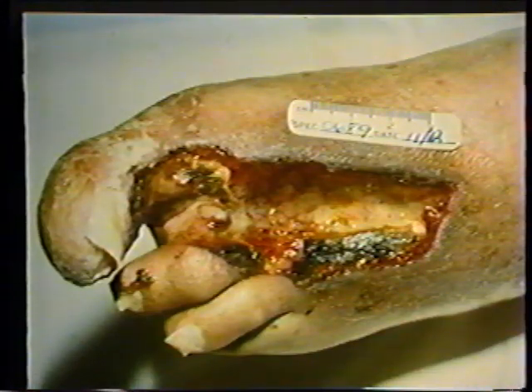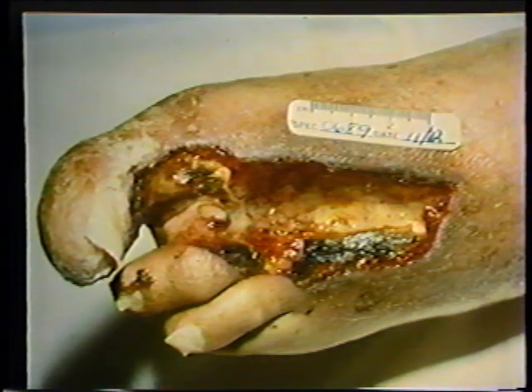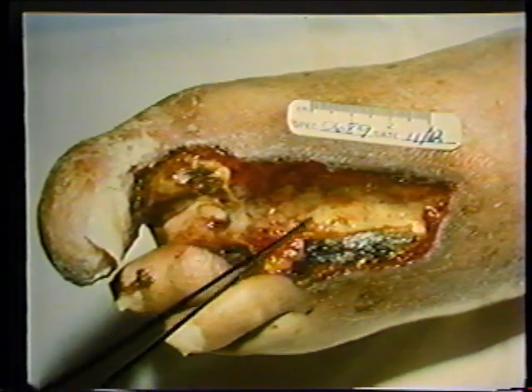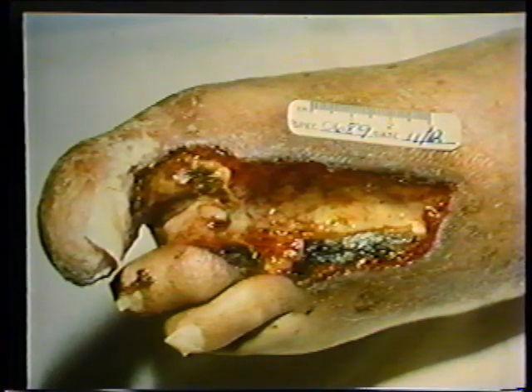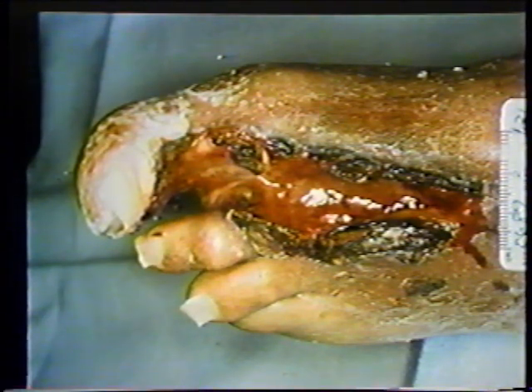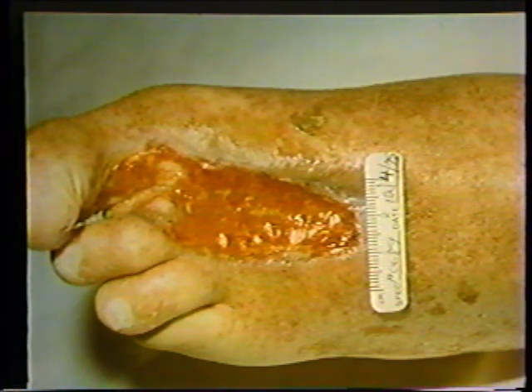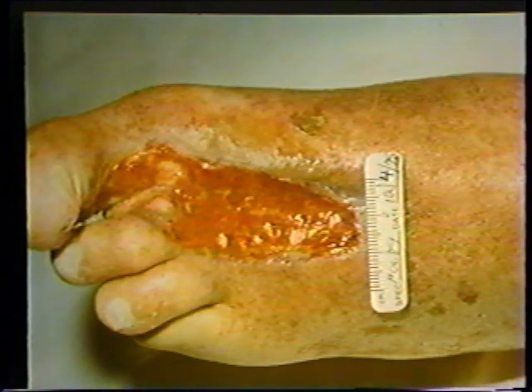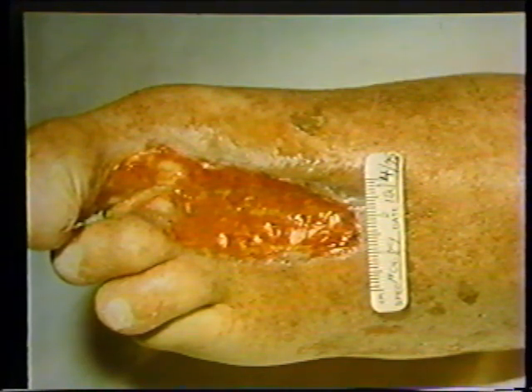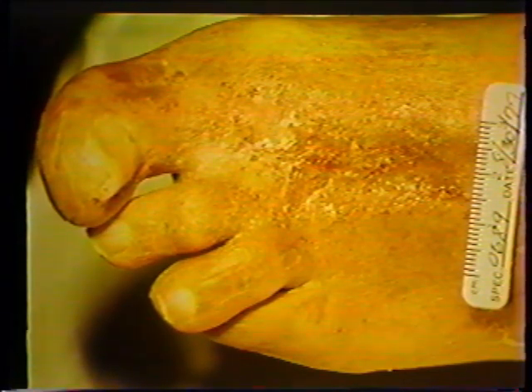Here's an example: a patient with severe arthritis with accompanying vasculitis. The surgeon was about to remove one more ray — he felt it was impossible to close the wound. Note the yellow, avascular base of this ulcer due to arteritis. We started treating this patient on November 12th, and by the 21st the base of the ulcer is now red, not yellow — we're getting some vascularity. By December 4th, he's ready for grafting. The surgeon was reluctant to put a split thickness graft on, saying it would fall off like a sheet of newspaper because of the patient's arteritis. But we prevailed on him. This is a 21-month follow-up — the patient had complete take of the graft. A very satisfied customer, despite the arteritis.